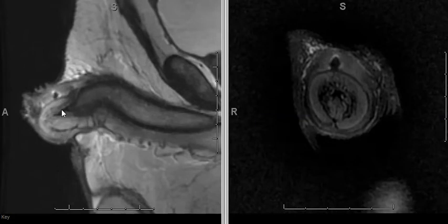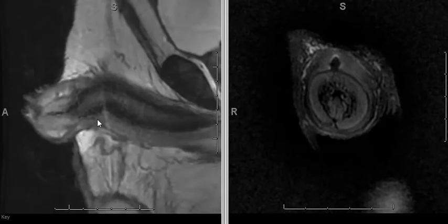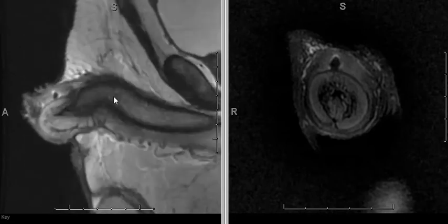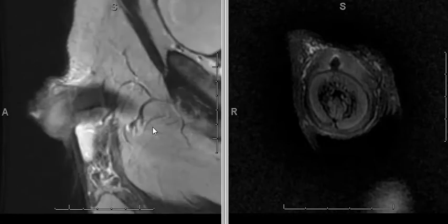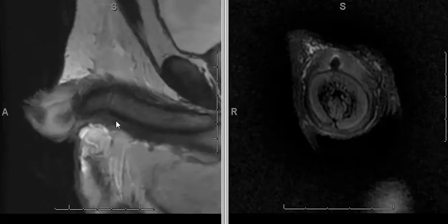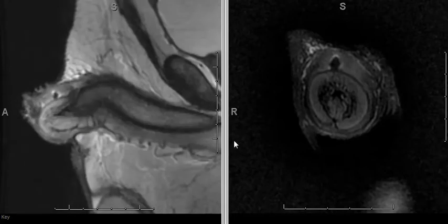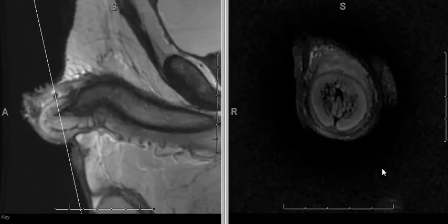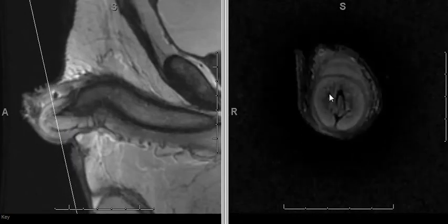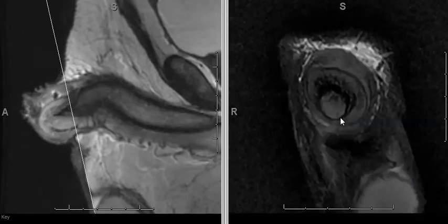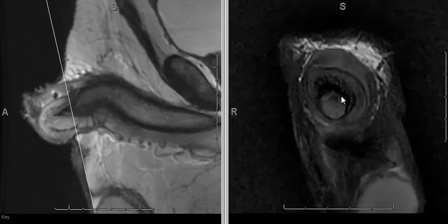You should also be able to visualize the glans penis and the corpus spongiosum and the urethra within it, and the corpus cavernosum with its thick tunica albuginea. The key sequence for staging of penile carcinoma is thin-section T2-weighted sequences perpendicular to the penis. Here you can see the glans penis, the urethral meatus, the corpus spongiosum, and the corpus cavernosum.